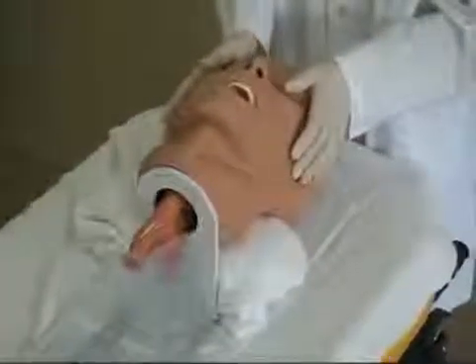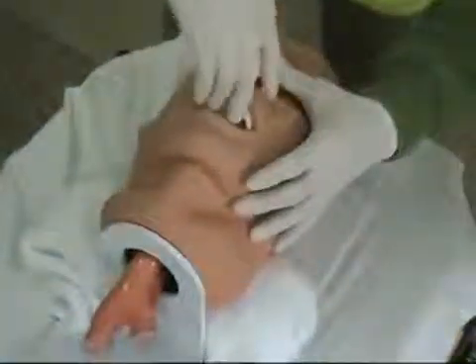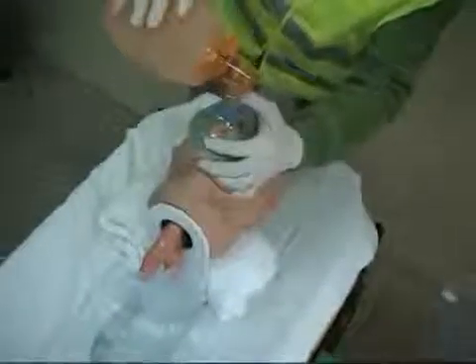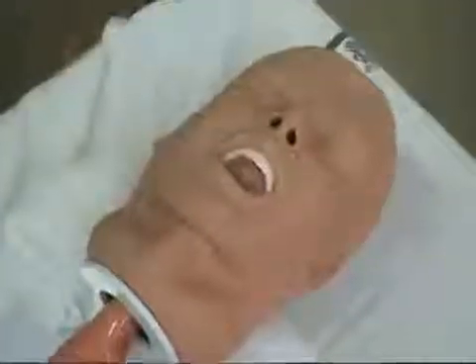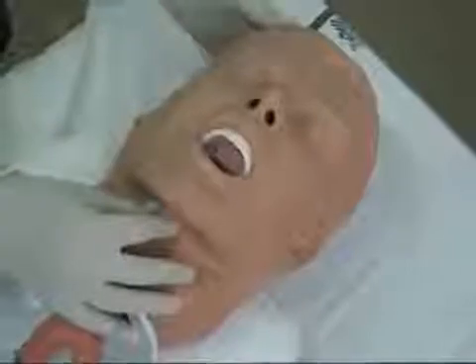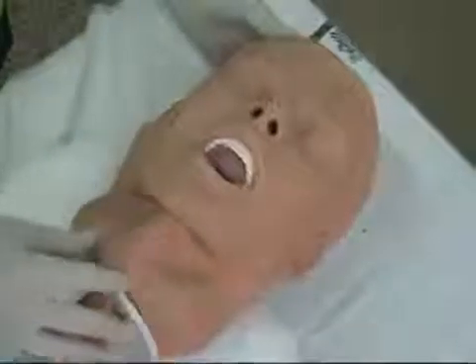This position will increase the alignment of the axis of the oral cavity, pharynx and larynx, which will enhance the visualization of the vocal cords. In a real patient, we should pre-oxygenate the patient with a bag valve mask attached to oxygen for at least 3 minutes. An assistant should perform the Sellick maneuver by applying a firm pressure on the cricoid cartilage to prevent the regurgitation of gastric content to the airway.